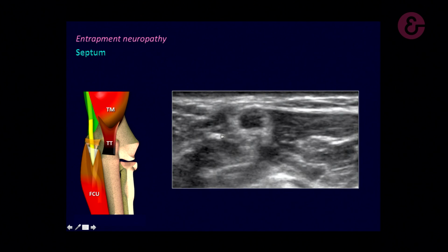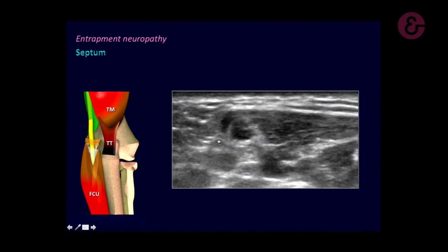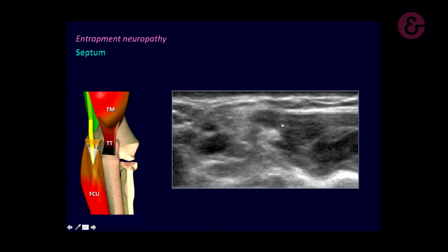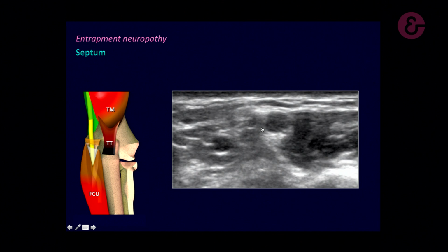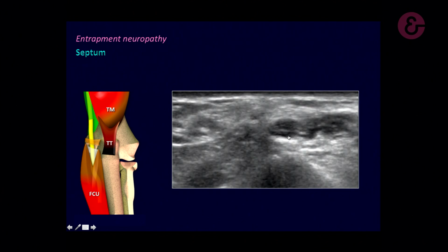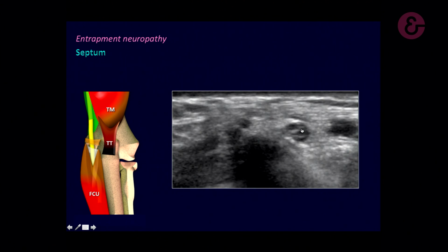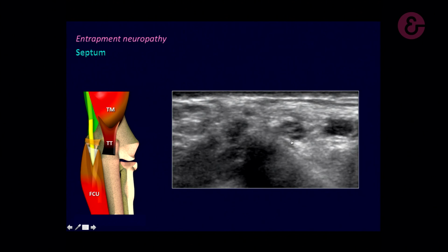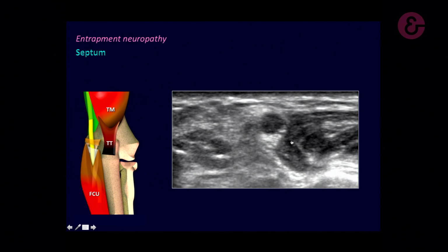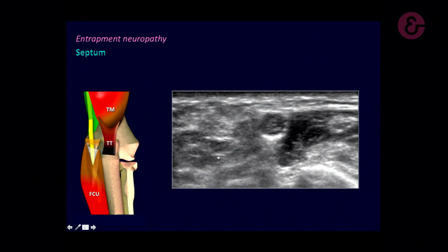Once again, anterior and then up posterior, and swollen over there. And if you move a little bit distally, really swollen, you can see the fascicles inside. At the level of the tunnel, the nerve becomes normal. So once again, the elevator technique. A compression in the septum.